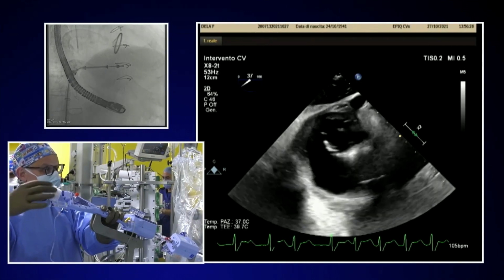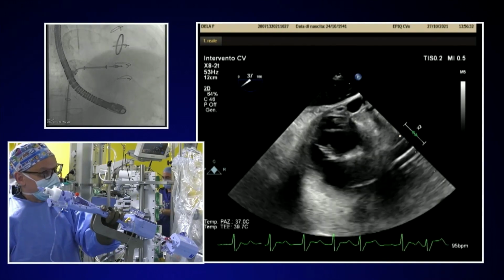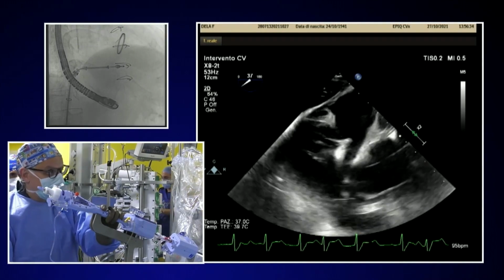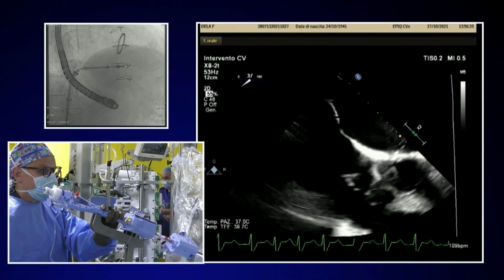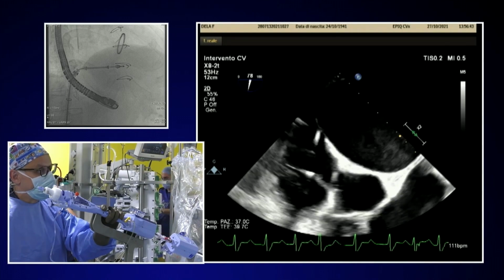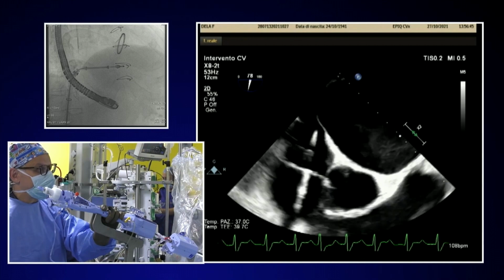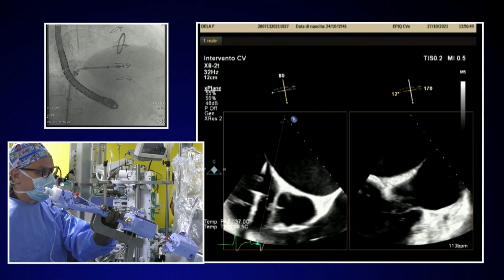Now I see that. I close the clip arms a bit more so I have control. I can see definitely the restriction of the anterior leaflet. We need to see if the septal is in. We wait for improving the image. Maybe the septal is not in.